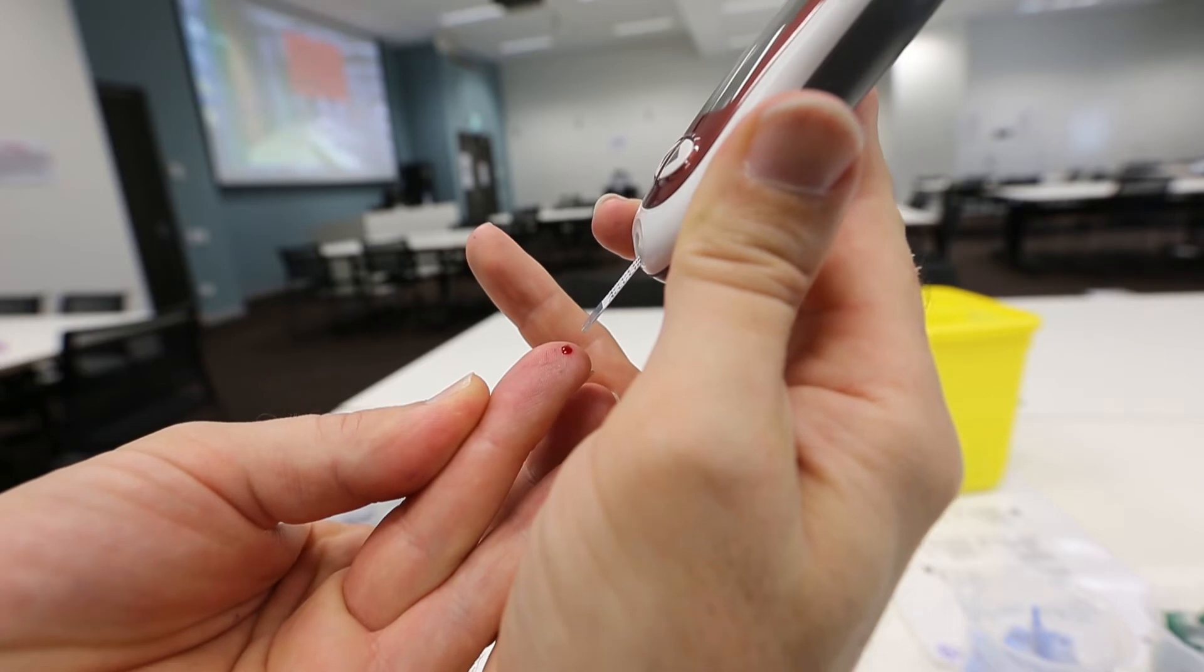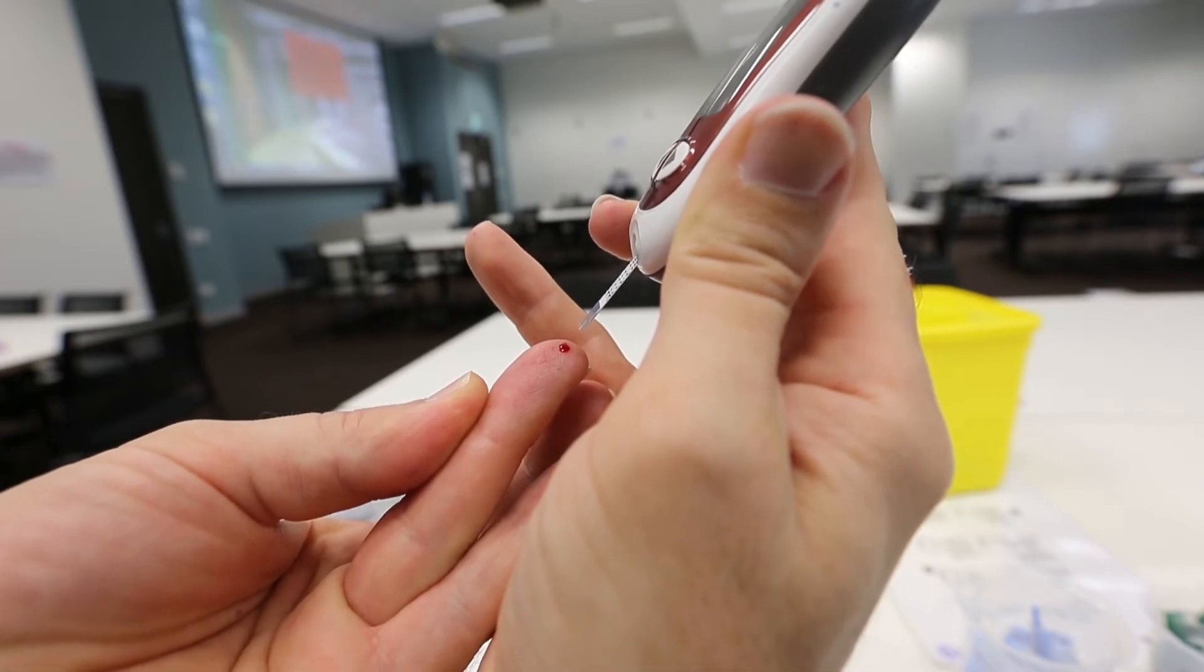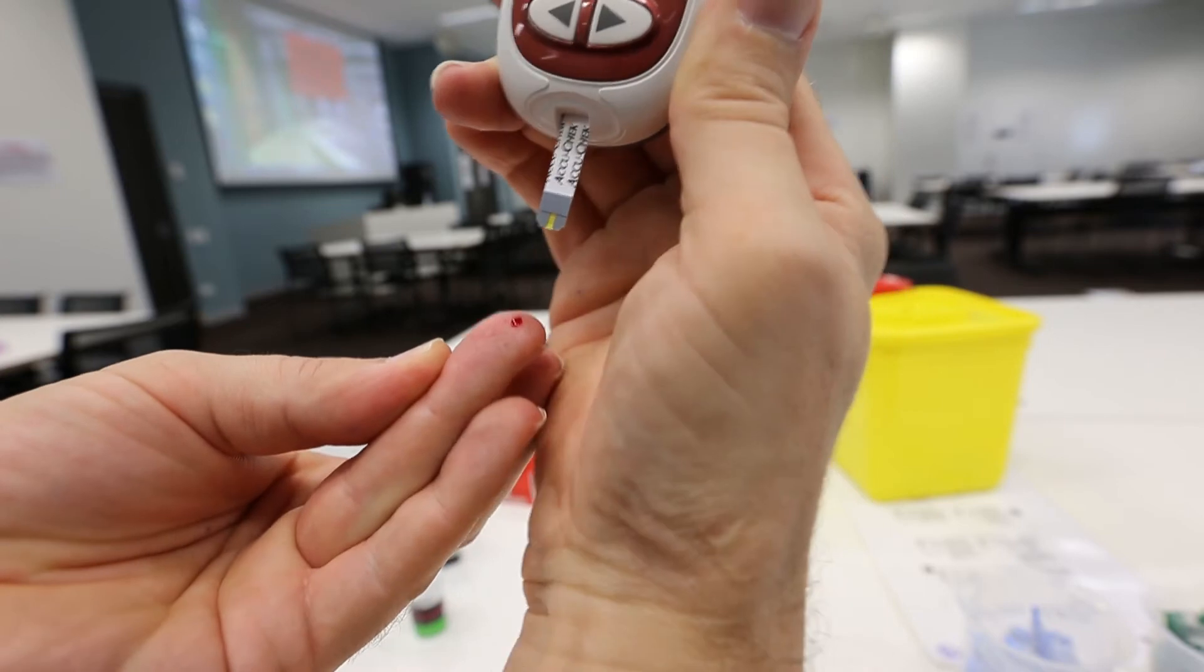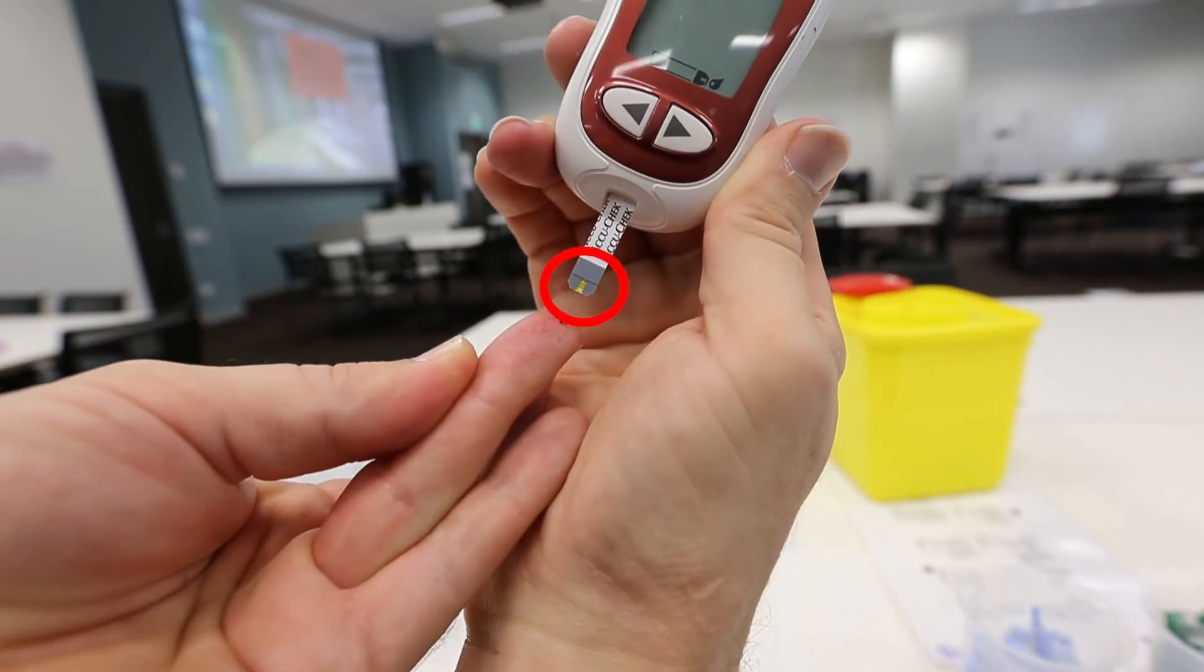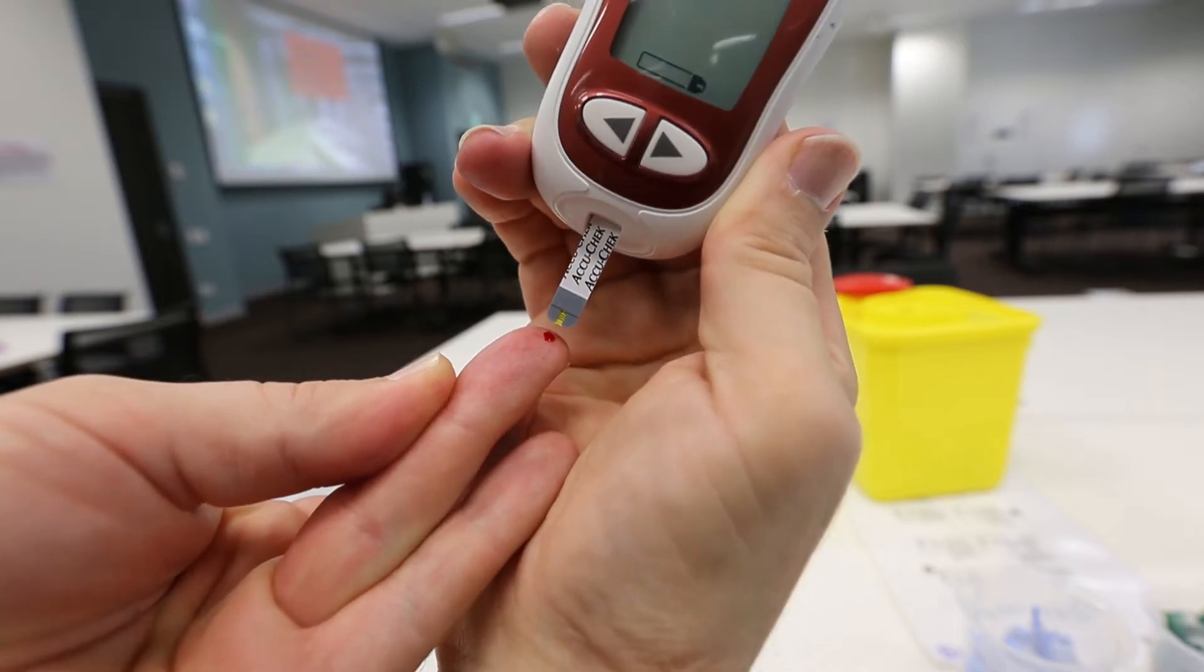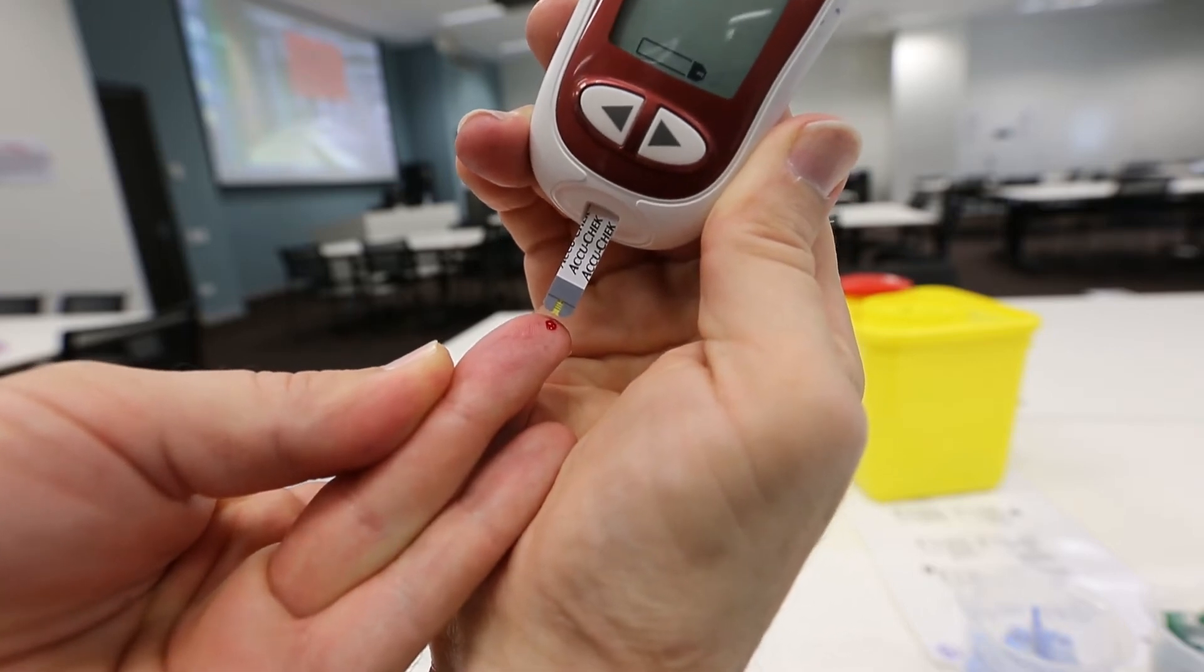To collect blood, touch the end of the test strip perpendicularly against the drop of blood that you have created. There is a plastic window over the yellow test stripe and blood will be drawn into the test area by capillary action. Watch carefully, and you will see the blood drawn up here.